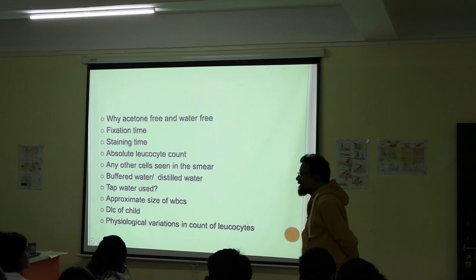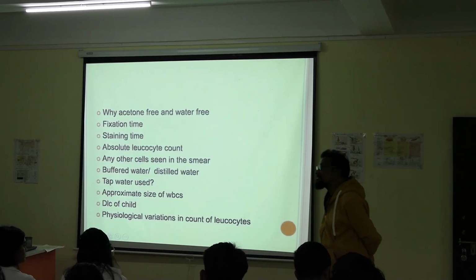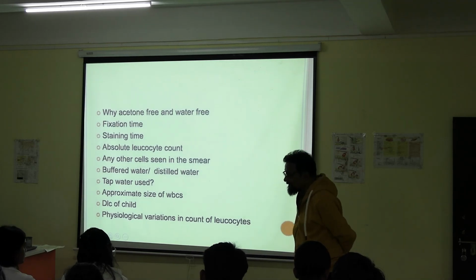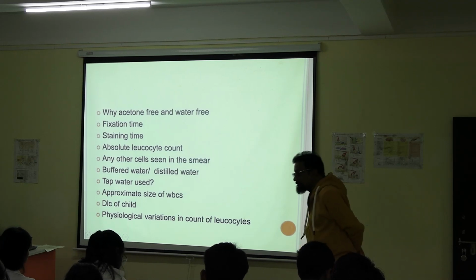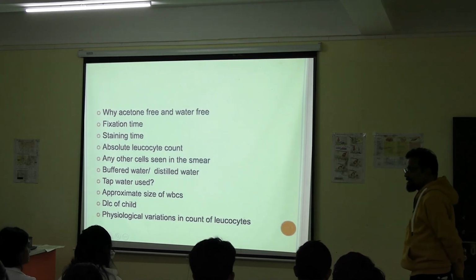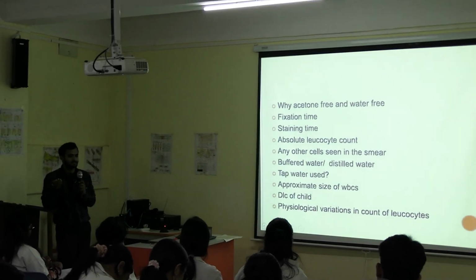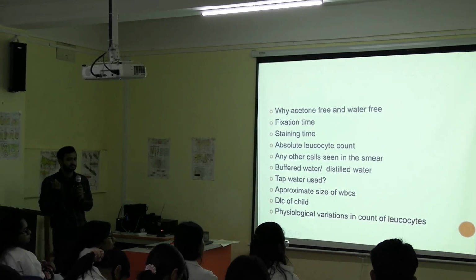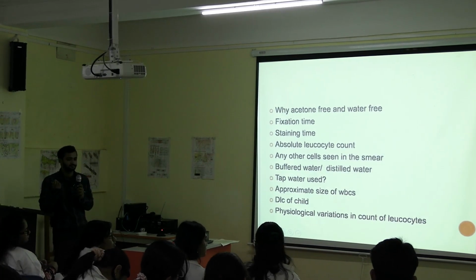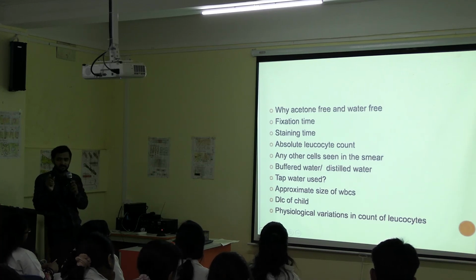You have seen the RBC shape is changed in some diseases. Sickle cell, anyway, so you can see sickles. Identify them. These are not normal, no? And in deficiencies also, like iron deficiency or vitamin B12 deficiency, the size and morphology, the size of the RBC varies. Macrocyte, microcyte. Then the approximate size of the WBCs, you have to compare it with an RBC. That is the reason, okay?